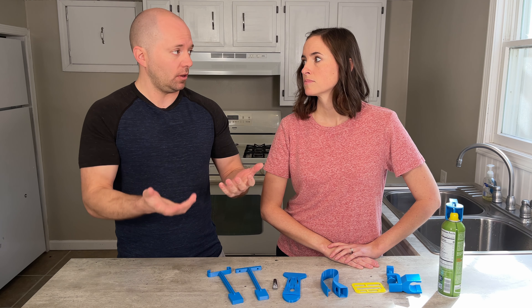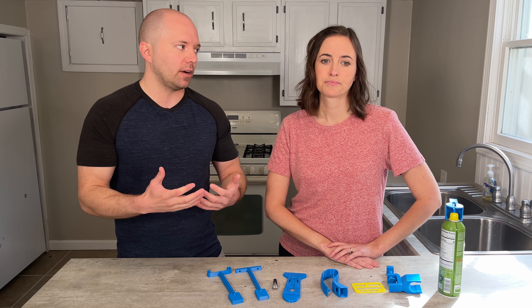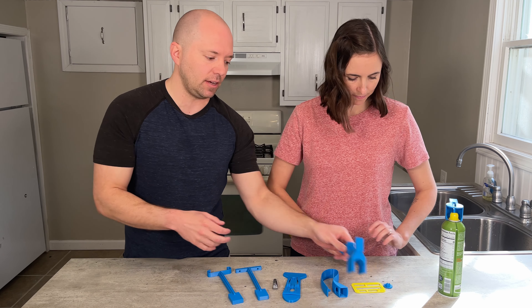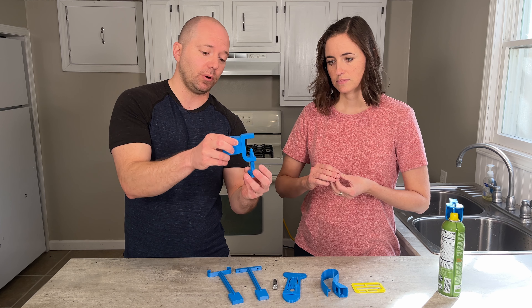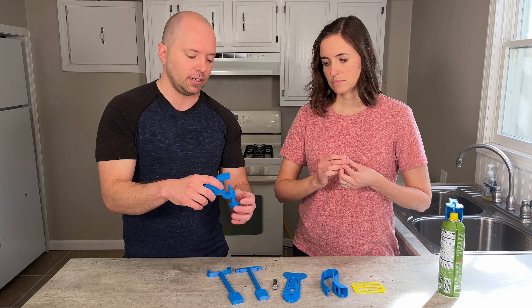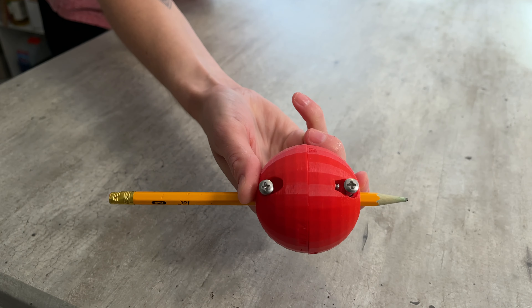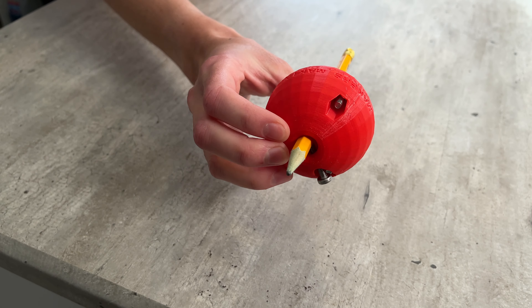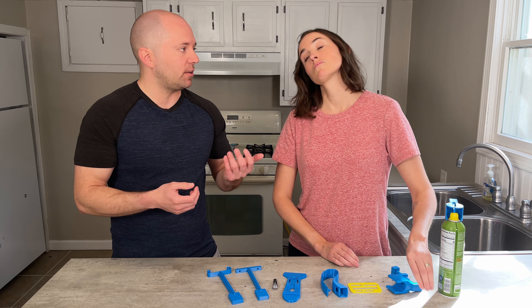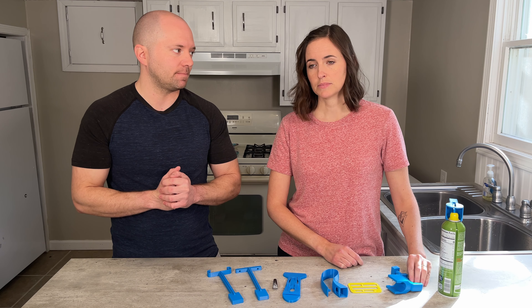Next, make sure when you're picking out a model that it has good descriptions — it tells you any technical details you need to know, what kind of filament it uses, and anything that needs to be set up with the 3D printer. Another thing to be aware of is whether the model requires supports, which means slightly more filament and longer time to print. Finally, check if the model requires any hardware — like this piece of equipment that has a bolt printed along with it. Hardware can be tricky because the tolerances — the spacing between things and the threads — can be very precise, and sometimes it's better to get solid hardware from a hardware store rather than 3D printing it.